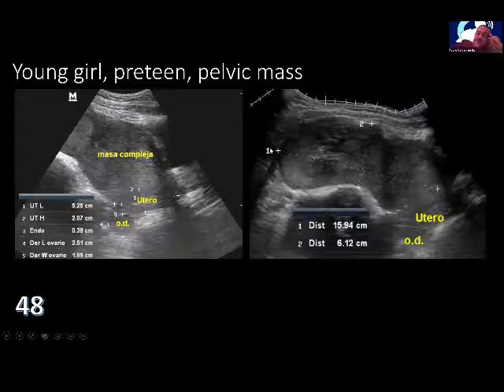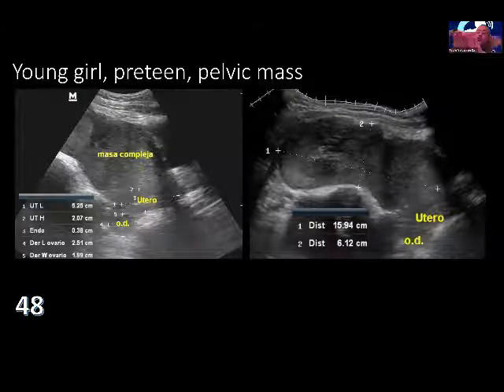Nice picture. Or just divide the screen in the two images you have here and attach the other one here. That way you present nicer, wider, more informative pictures.